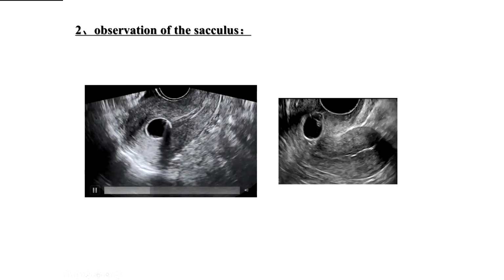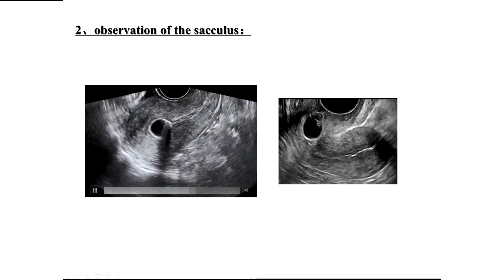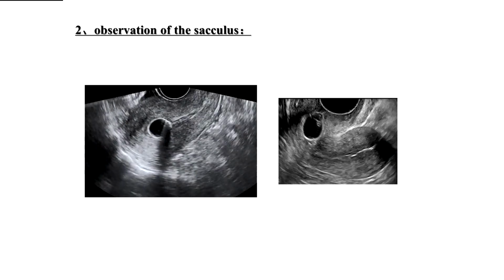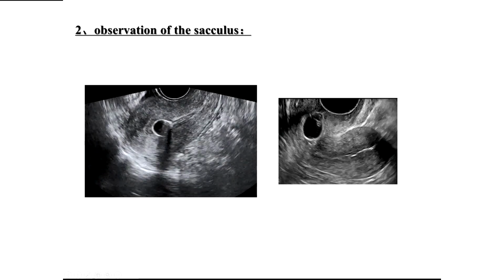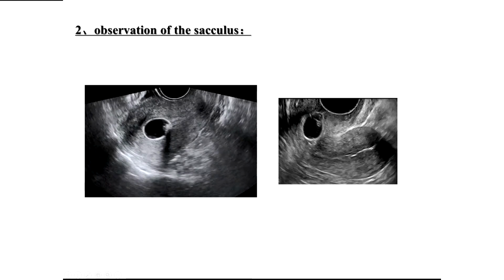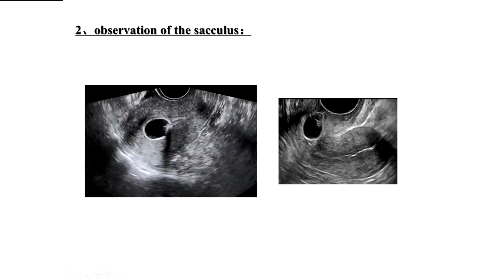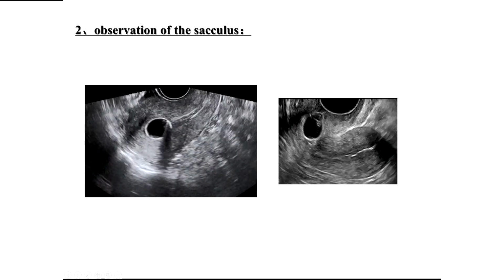And then we have to observe the balloon. First of all, we have to observe the size of the balloon. If it is too big, it will cause great pain for the patient and block the uterine opening, causing an artificial tubal blockage. If it is too small, the contrast agent will flow back and the balloon will drop off. Another big issue is the position of the balloon. Sometimes we find the balloon in the cervical canal, because the uterine body is too anteflexed or retroflexed. If we find that the balloon is lodged in an unhealed cesarean scar, there is a potential risk of uterine rupture if we ignore it.